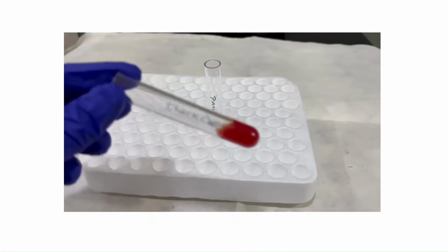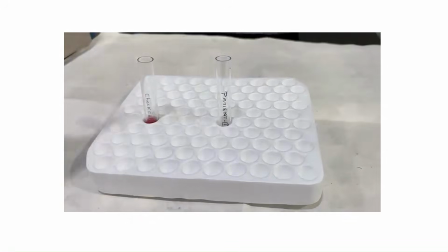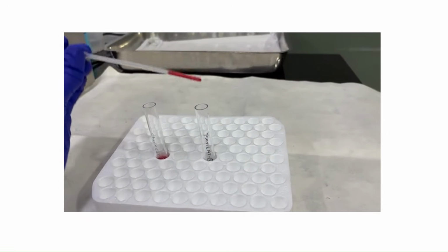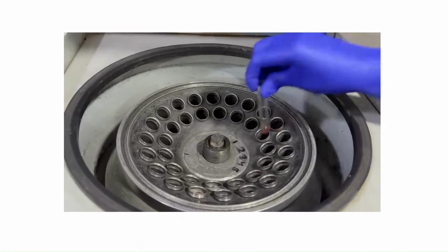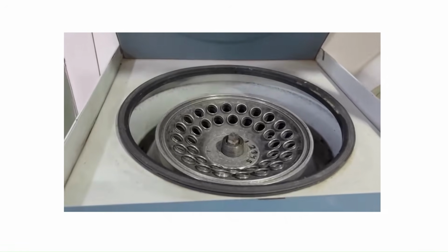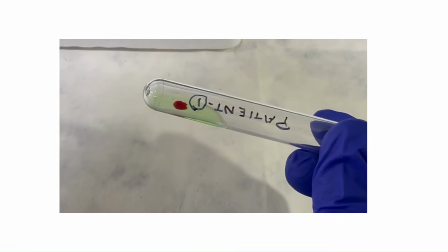To validate DAT negative results, check cells, also known as Coombs control cells, which are IgG sensitized red cells, are to be used. So hence we have taken the check cells, and the result which came negative for us is patient 1. We have taken patient 1 and 1 drop of check cell is being added into the test tube. After centrifugation, we can see there is 4+ agglutination reaction which validates our test.